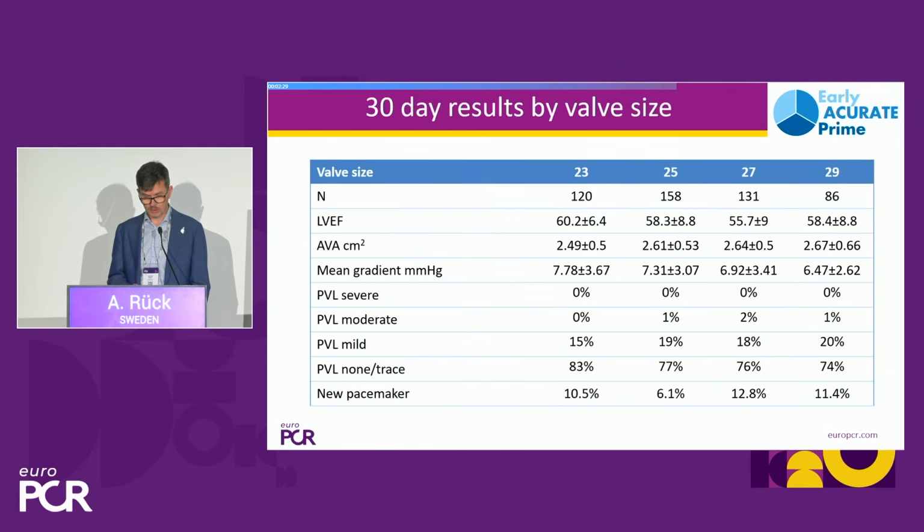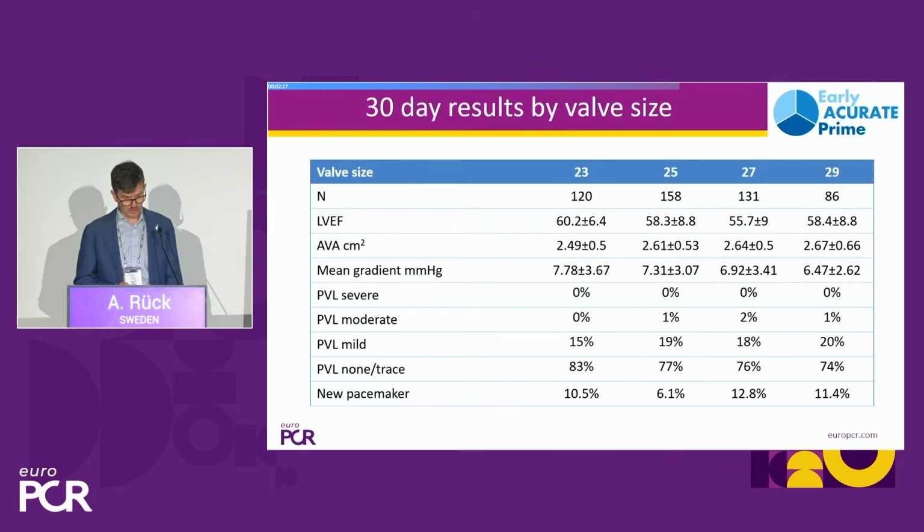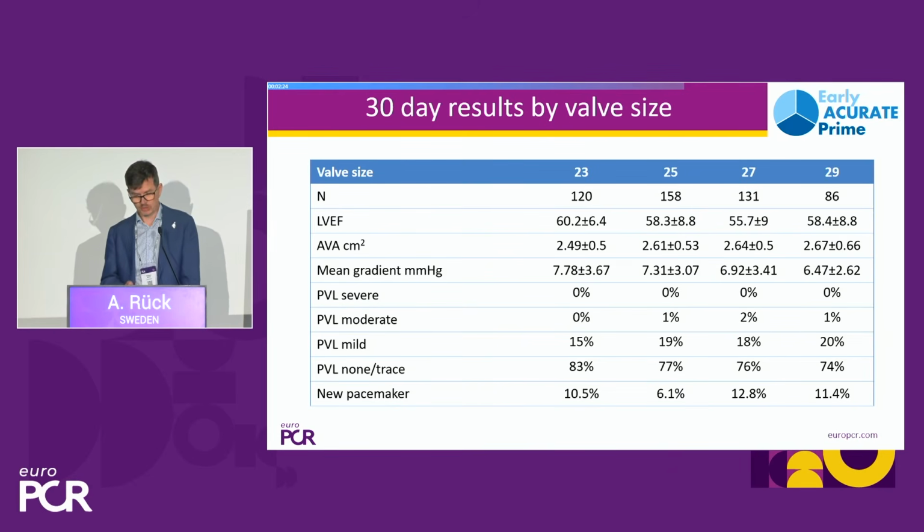Then I put this table in. This one was not shown yesterday, so this is the split by valve size. Obviously, lower numbers per valve size, so especially for the 29 valve size, which is new.